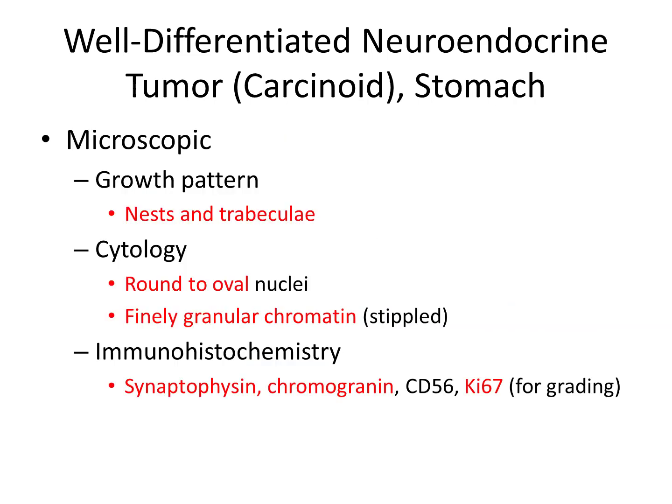Carcinoid tumors may show a variety of growth patterns, but nesting and trabecular growth is most common. They may form rosettes, papillary structures, pseudoglandular structures, and may even display solid growth. The background stroma is typically highly vascular and composed of delicate capillaries. The cells are positive for synaptophysin, chromogranin, CD56, and INSM1.